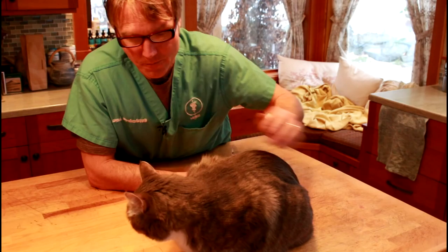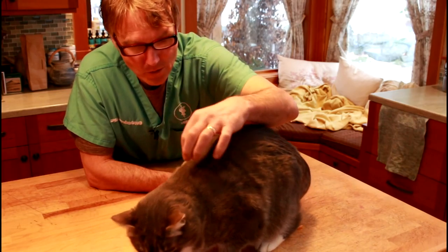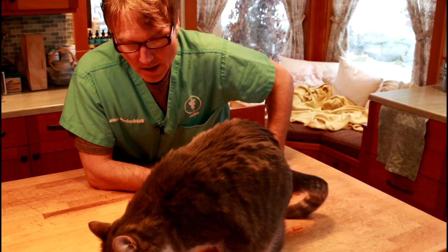And generally that's what I'm finding. I'm using a sharp needle, I'm giving him food first, fully seating it, and pushing it in pretty quick. So there it is — that's how to do a proper injection on your dog or your cat.